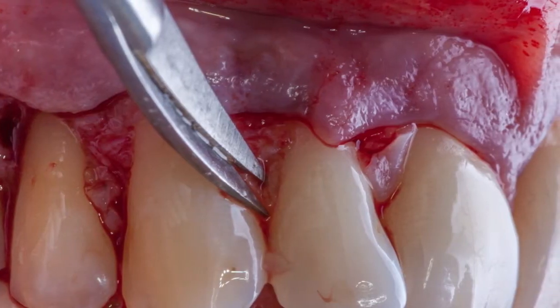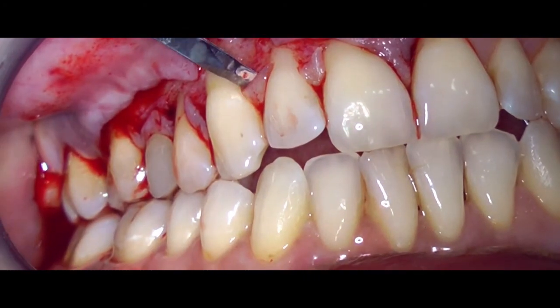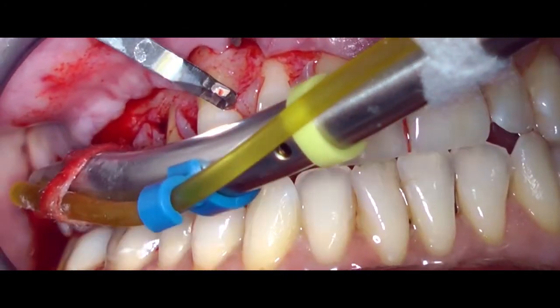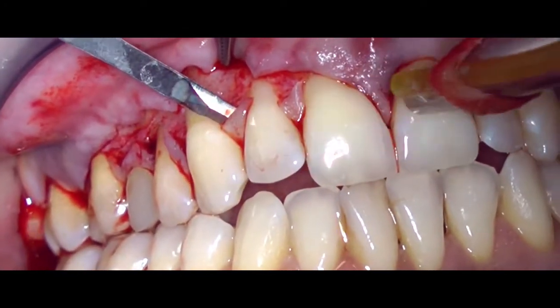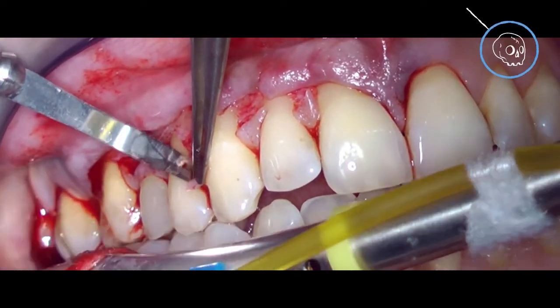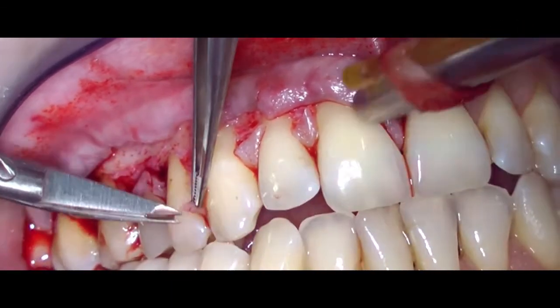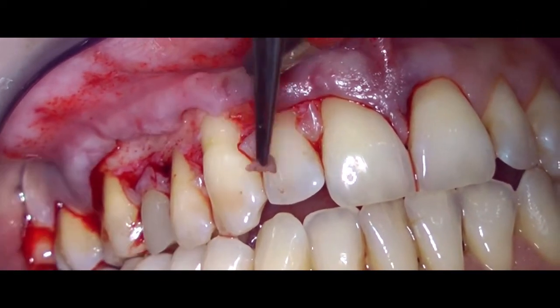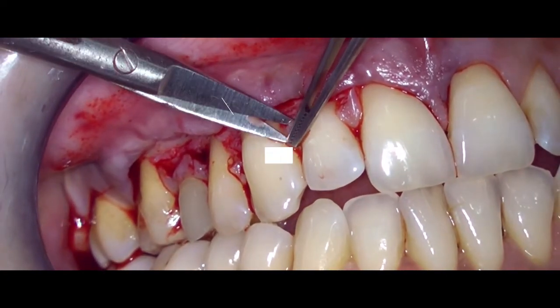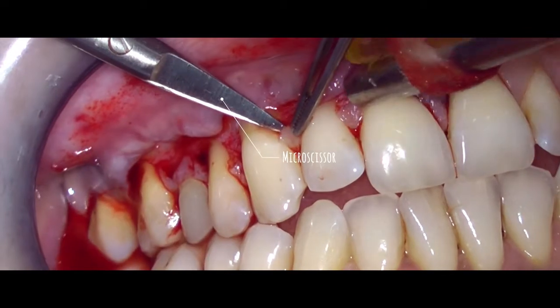The next step consists of de-epithelializing the anatomical papillae. In order to complete this task, I like to use a micro scissor or the tip of a blade. Some other clinicians might prefer to use a microblade. The important aspect is to be sure that there are no remnants of the epithelium on the papillae, as they will serve as a vascular source for the surgical papilla that we created.